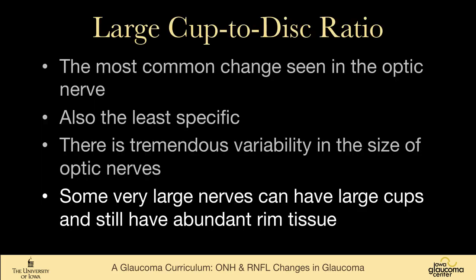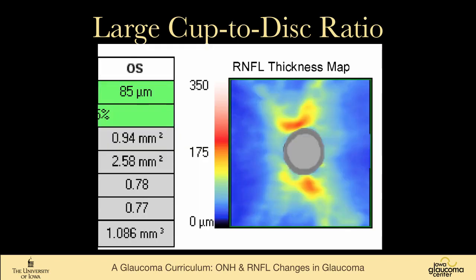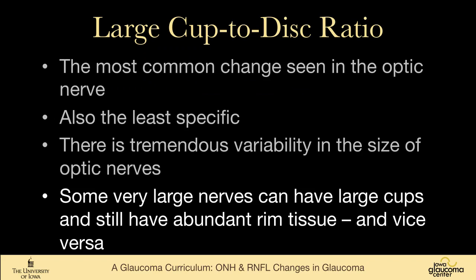So some very large nerves can have very large cups and still have abundant rim tissue. This is a patient with a large nerve, large cup, but normal nerve fiber layer. And vice versa. One can have a very small nerve and a small cup, but still have significant nerve fiber layer loss. It's just difficult to see.